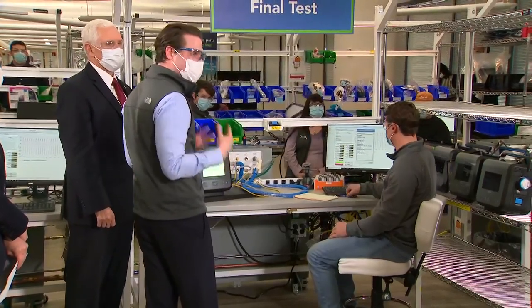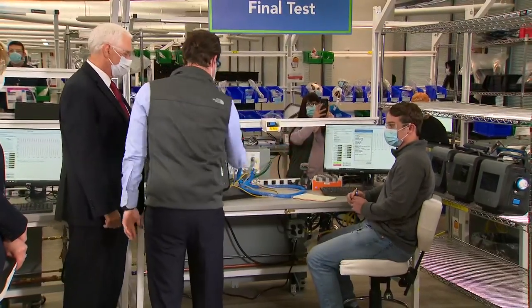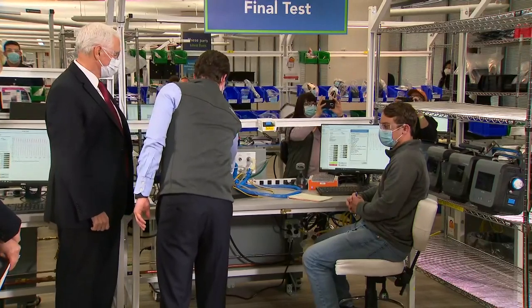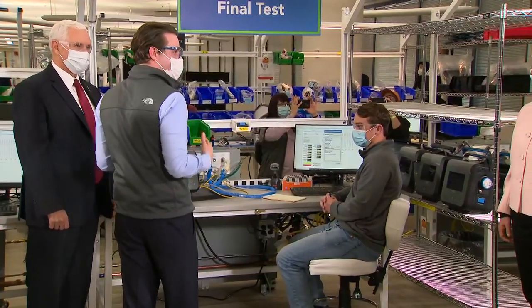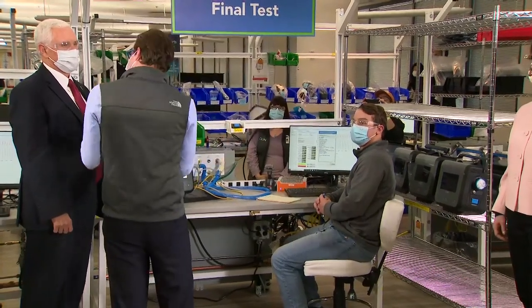So when you think about respiratory therapists, think about all the stress they're under, the real heroes here. Really simple and easy. The hardest thing on this thing is to say, when in doubt, exit out. You exit back again. You can see your monitors. For a critical care ventilator, you have to understand how your patient's reacting. The machine and the human have to breathe in concert.